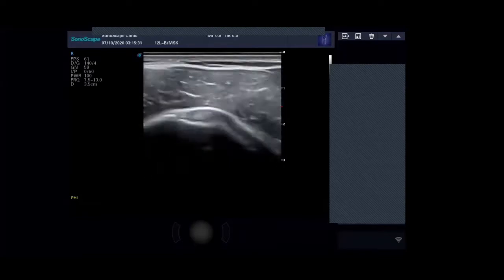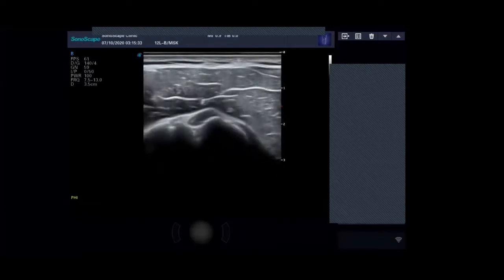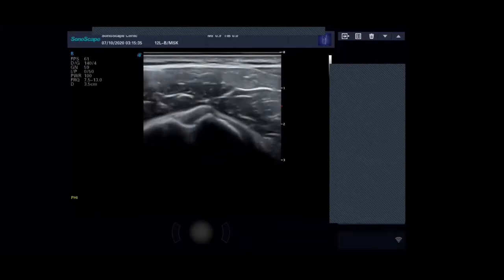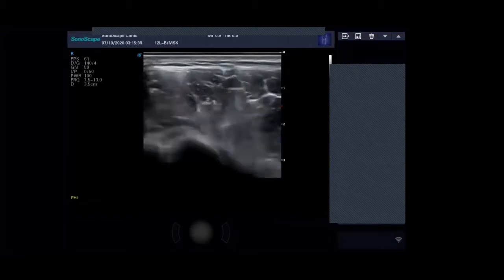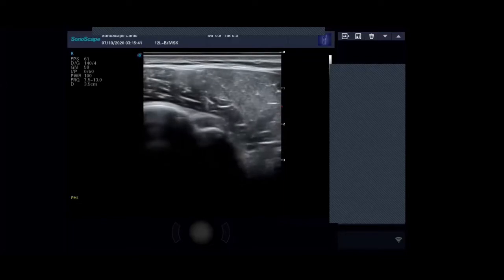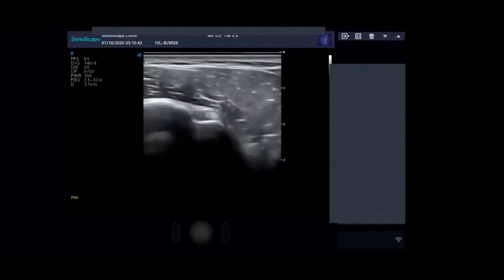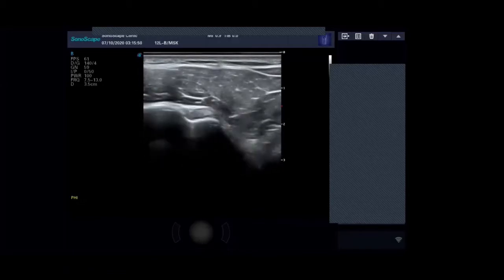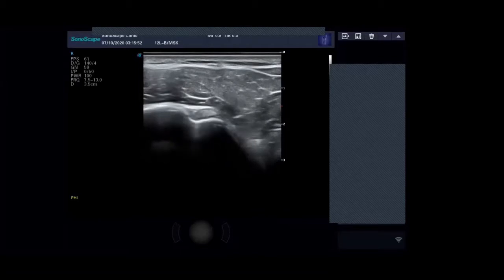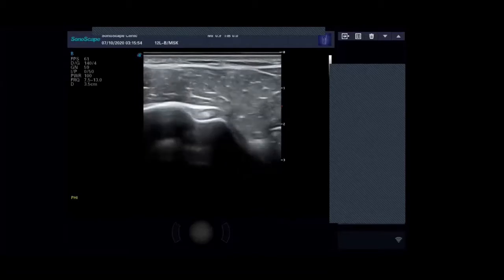The normal thickness of this tendon, I think they say anything above 2.5 millimetres is classed as thickened in terms of pathology. So when you scan enough of these, you should just eyeball it. I tend to do enough of these now to just look at it, and if I think it's thickened, perhaps compare it to the other side if that's asymptomatic, and then that will give you a good indication, but you can measure it if you want to.